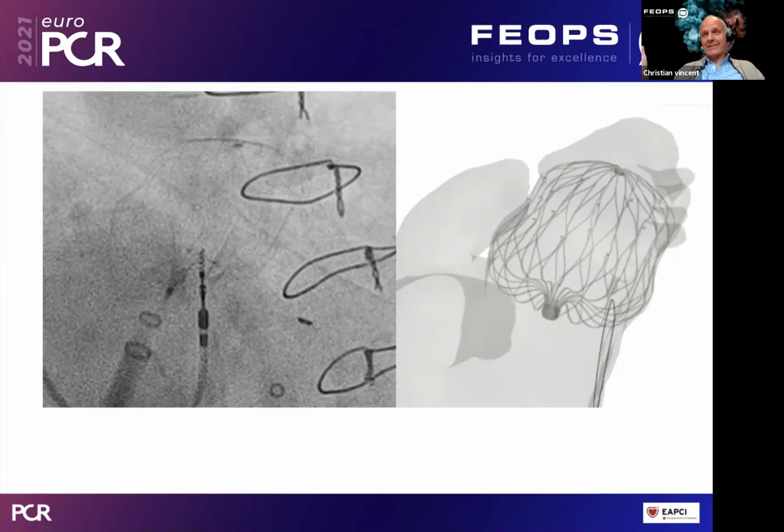I didn't know exactly what we could expect. First of all, FEops HEARTguide is a tool convincing the physician, but you were also very convincing with your practice based on your personal experience. I just have a small question before we conclude this call.